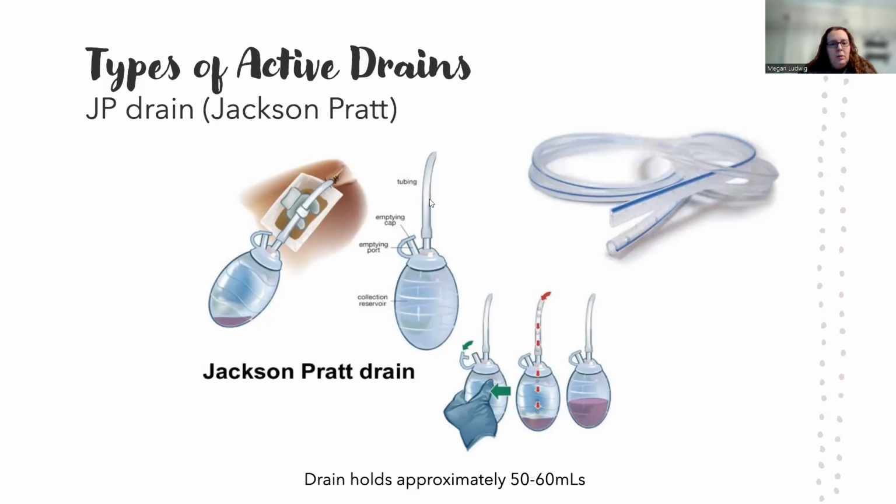So the tubing gets attached to the top little port opening, and then there's an emptying port. So to assist the surgeon in placing this drain, okay, it's going to go in the incision.